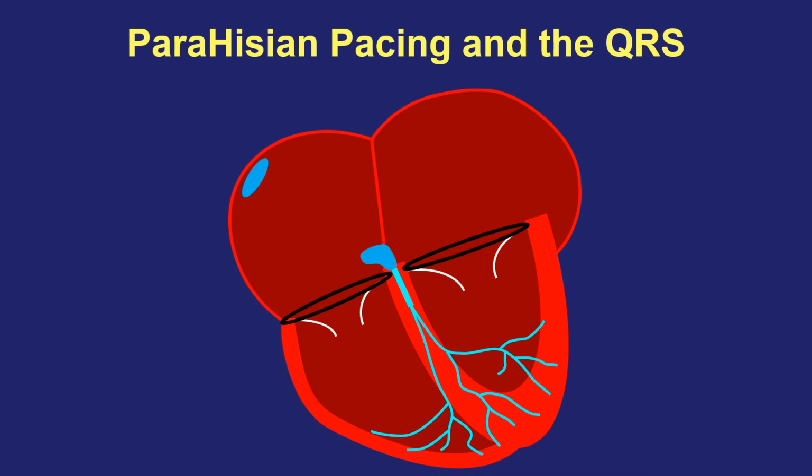It's a wonderful technique that I love doing in every SVT case. When people explain this, one of the things that they sometimes forget to mention, and it is critical to understanding how this maneuver works, is the anatomy of the His-Purkinje system. The His-Purkinje system, as we discussed, is lightning fast in the forward and the backward direction.